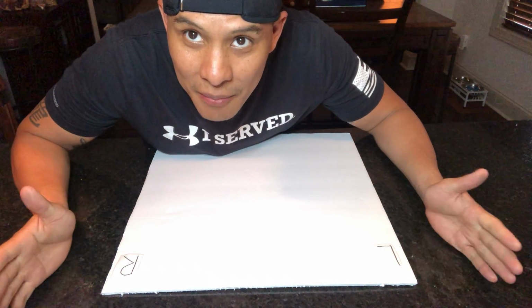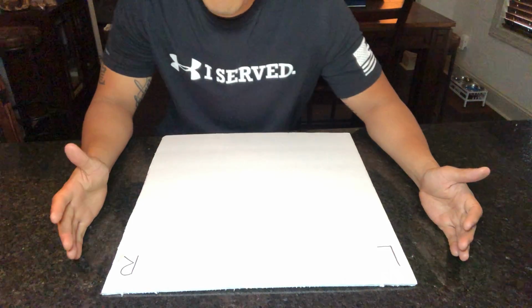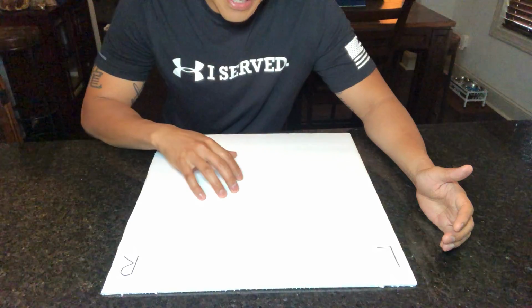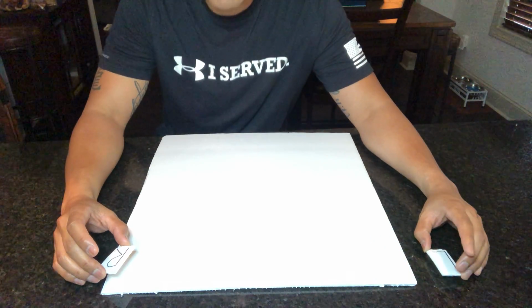I am here to show off some projections today, including the hand, the wrist, and the forearm. This is my 17 by 17 poster board that I'll be simulating as a tethered DR panel or cassette. I have my markers here as well. We're going to start with some hand projections.